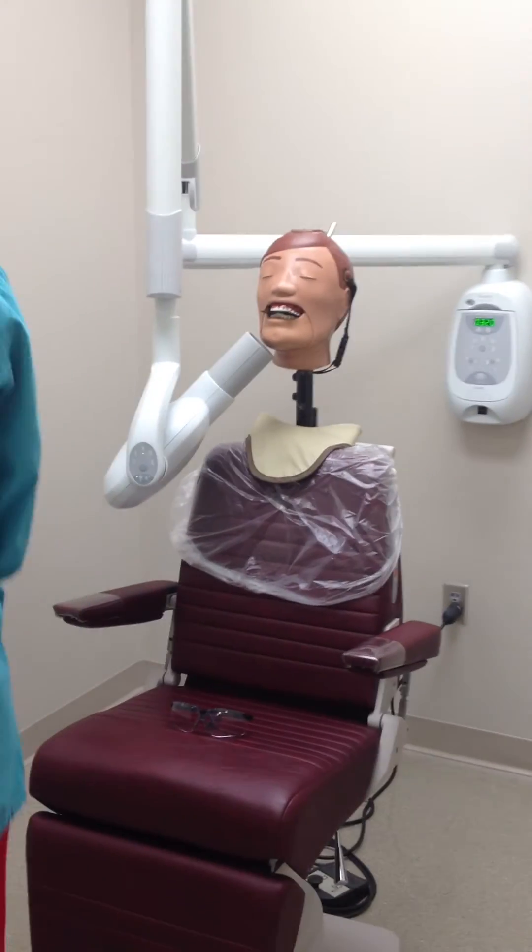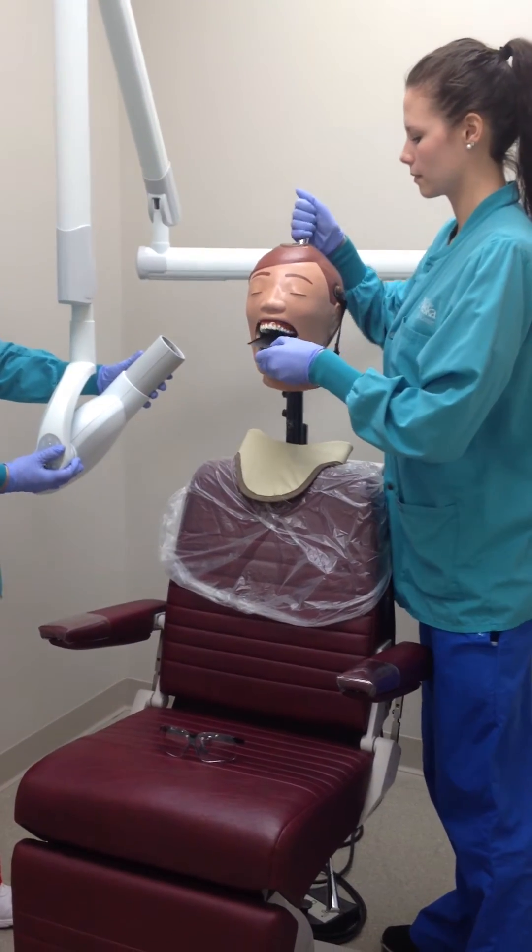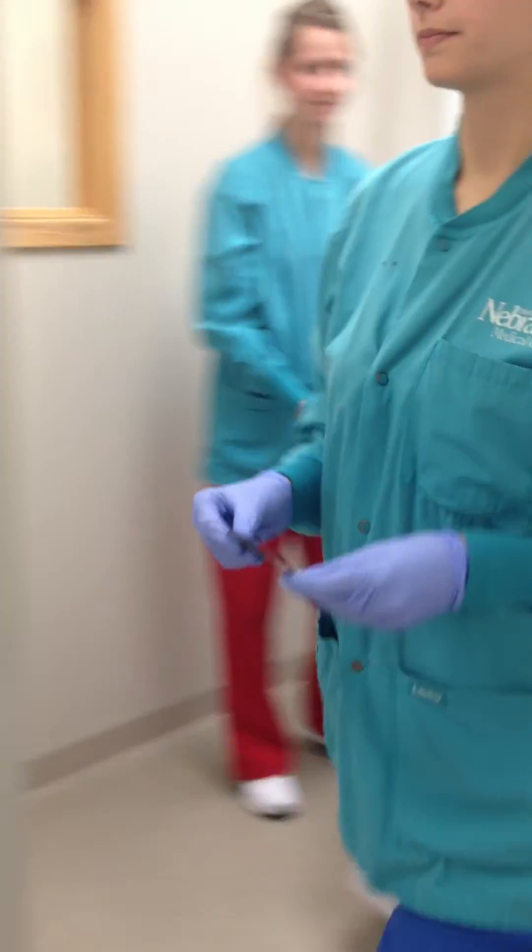Then return to the patient to remove the image receptor and clear the PID out of the way. Take the receptor and dry off before taking it to the exposure room.